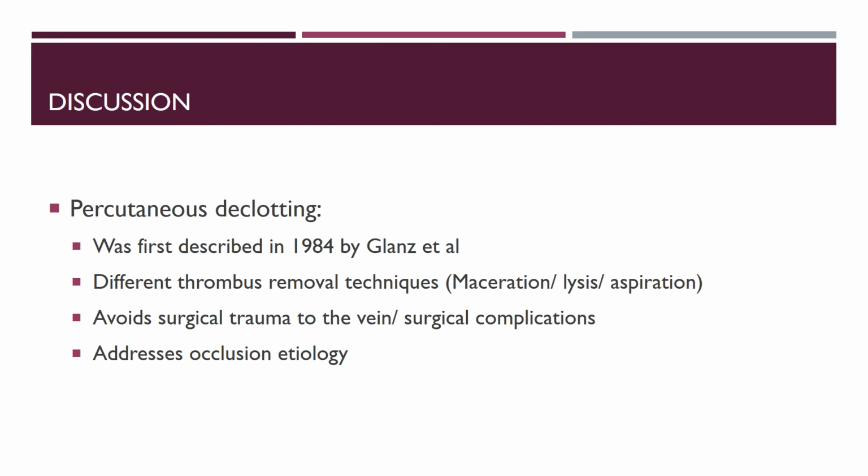Percutaneous declotting. It was first described in 1984 by Glanz et al. It can employ different thrombus removal techniques like maceration, lysis and aspiration. It can avoid surgical trauma to the vein as well as the known surgical complications. Can effectively address the occlusion etiology.